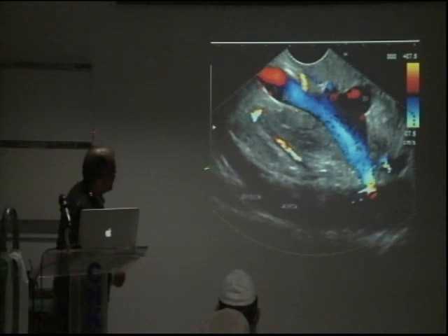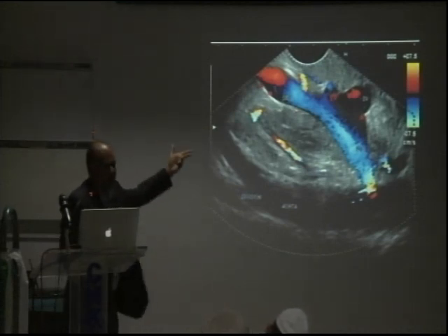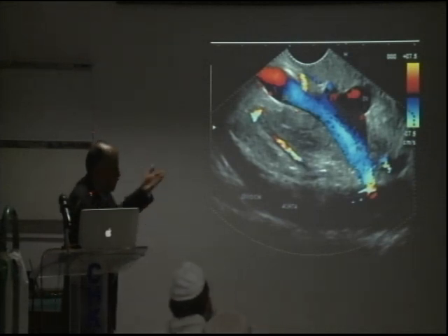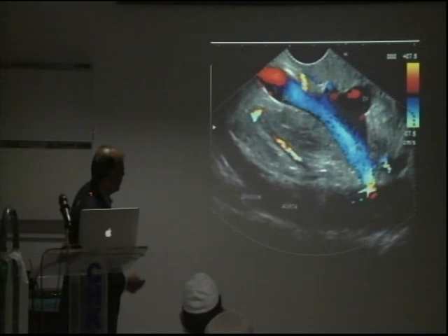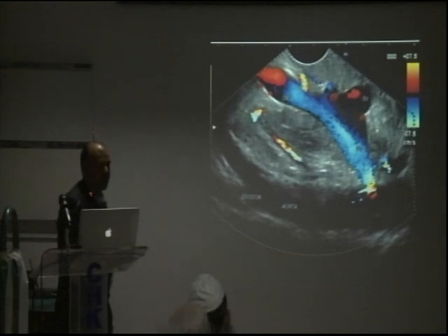So now imagine, the portal vein was coming here like this, going like this. The bile duct was coming like this, going like this. Portal vein was like this, 45 degrees. And you had the hepatic artery coming from here, going like this, right? Now flip the picture. So this is now what is happening. The splenic vein was coming from here and joining it like this, right? Now you flip the picture. Once you flip the picture, the splenic vein is coming like this. The pancreas is actually above. The liver coming like this. This portal vein was going like this. The bile duct is now here because it was here, right?